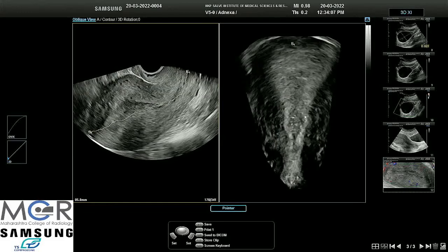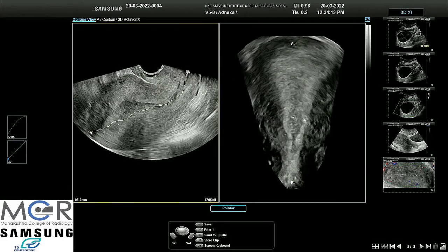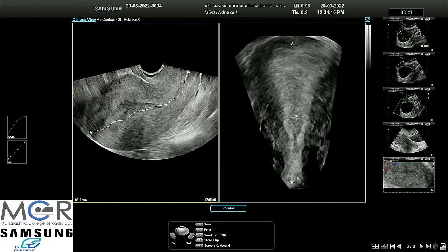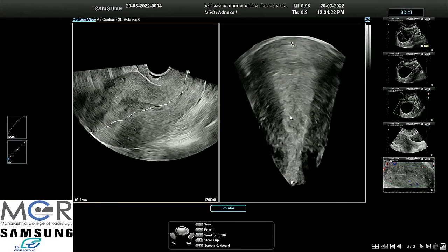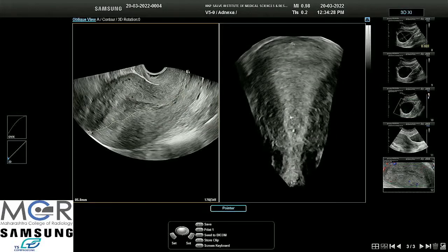MRI no doubt is the modality of choice for showing the interface between the myometrium and the endometrium, but with the introduction of the 4D transvaginal probe we are getting equally good images. The sensitivity and specificity of diagnosis is going as high as 95%, which is very good, and ultrasound is easily available and more easily done than MRI.